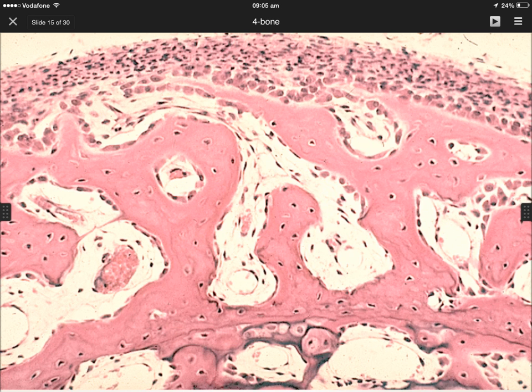Here you can see the irregular bony trabeculae, which is acidophilic in staining. And in the picture also you can see these irregular bone marrow cavities. So you will describe or you will diagnose structures in the bony trabeculae and in the bone marrow. In the bony trabeculae, on the surface, as you see, we have dark oval cells, free, not imprisoned in matrix, so they are called osteoblast.